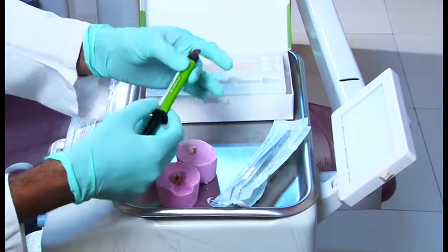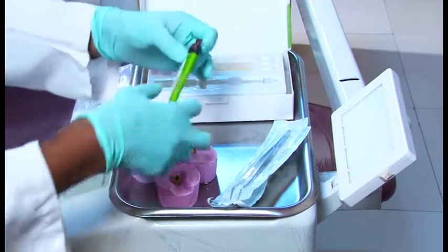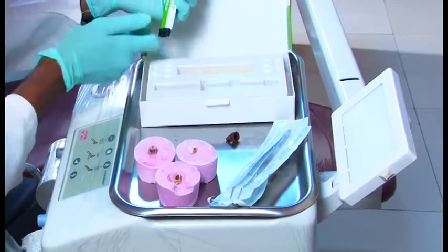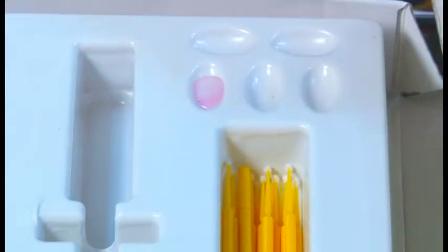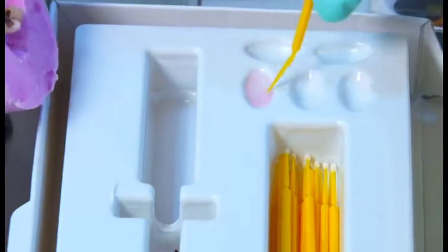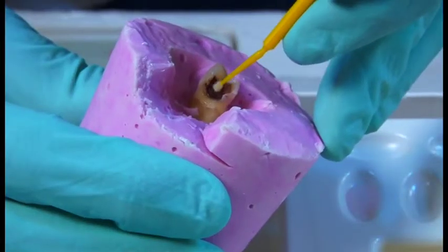One cartridge contains amino acids — three differently charged amino acids — and sodium hypochlorite. What you do is you dispense this into the pits provided by the company. Take an applicator tip and mix it. Here is the cavity — apply it into the soft caries.